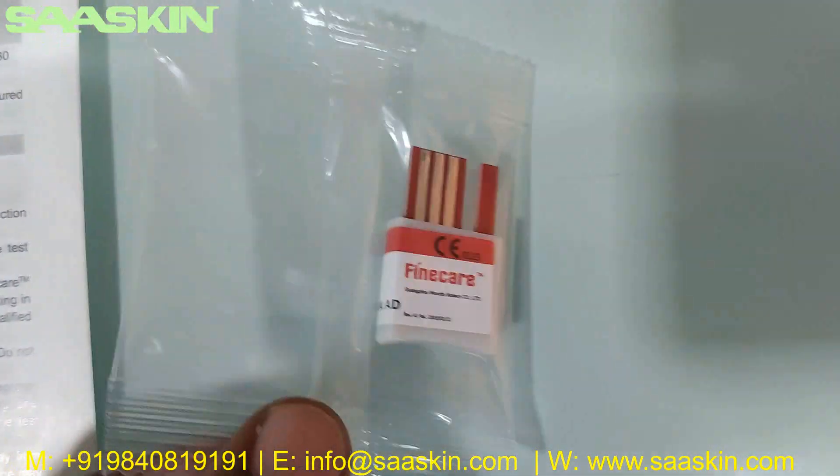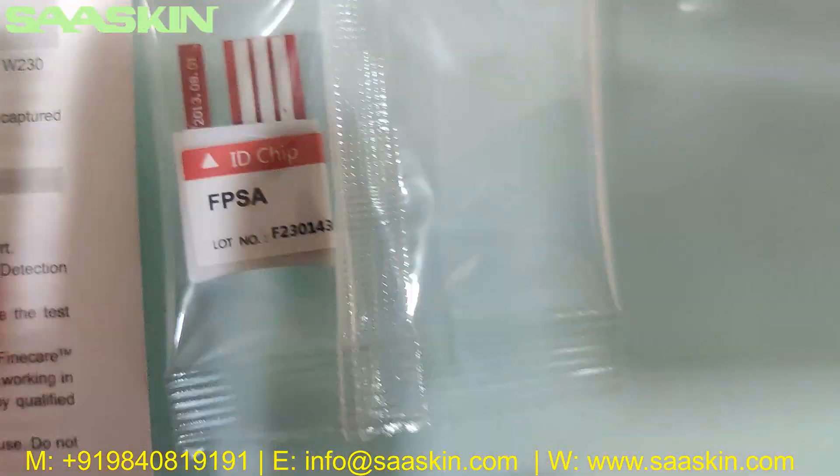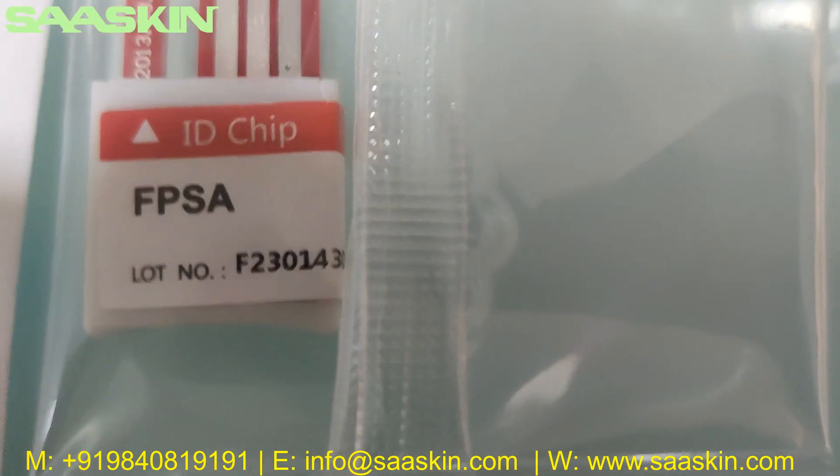And inside you can see there is an ID chip. Here is the ID chip. It says FineCare and also has the marking for the test and the lot number.